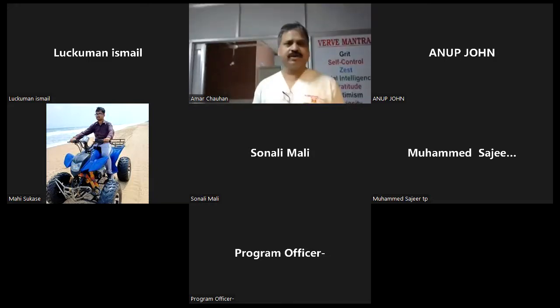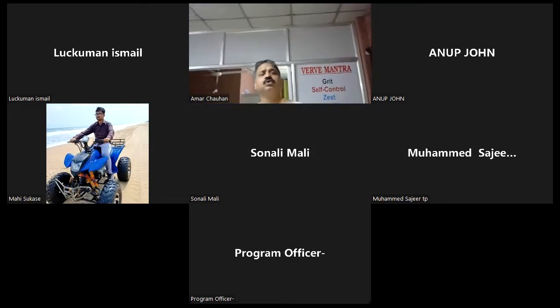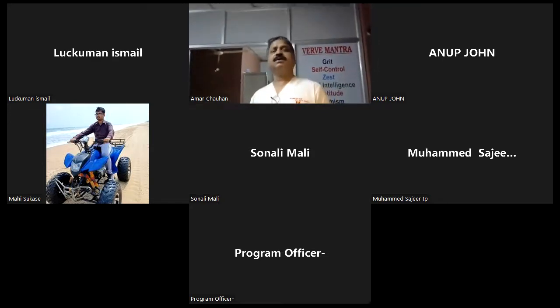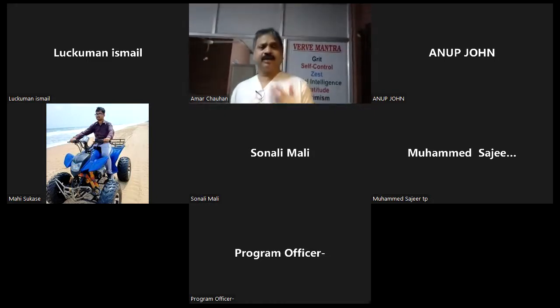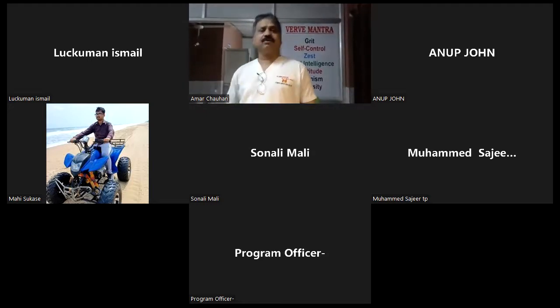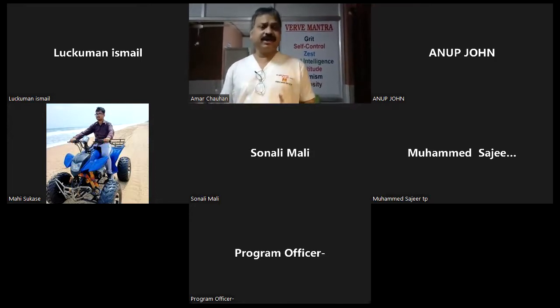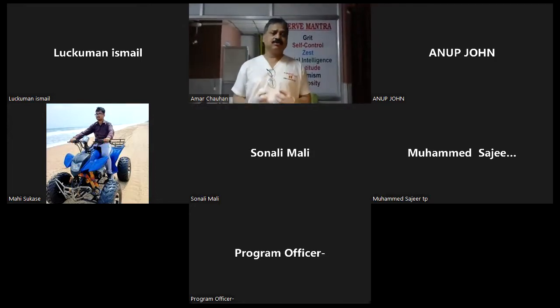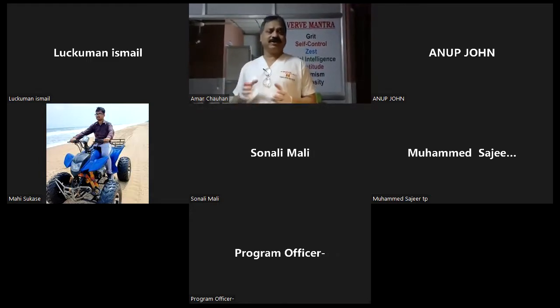So I'll be demonstrating the stop the bleed mannequin in a minute or so. These are our mannequins, but if you need any other kind of mannequin, we can make them. Our mannequins have proper landmarks. They have electronic pulses as compared to other mannequins which have manual. In case of tension pneumothorax, I would like to emphasize that we have electronic tension pneumothorax.